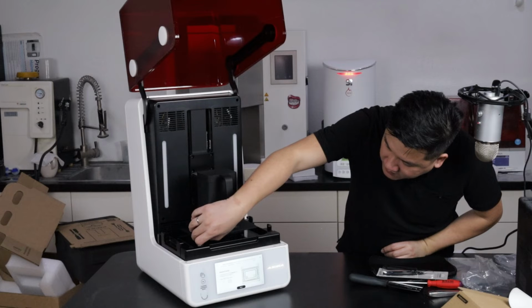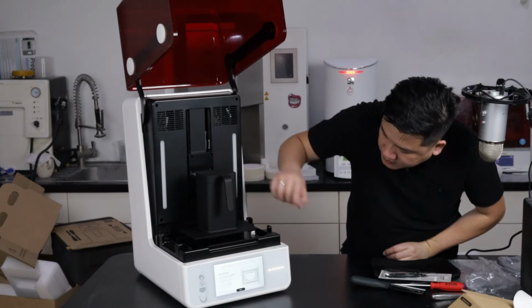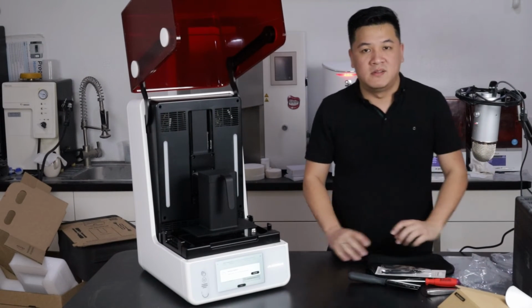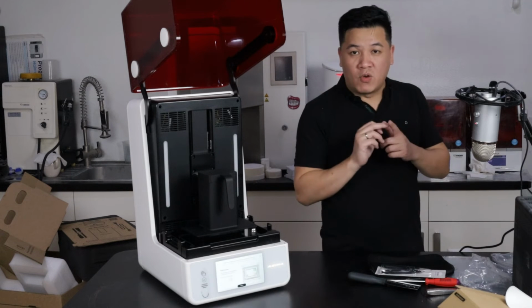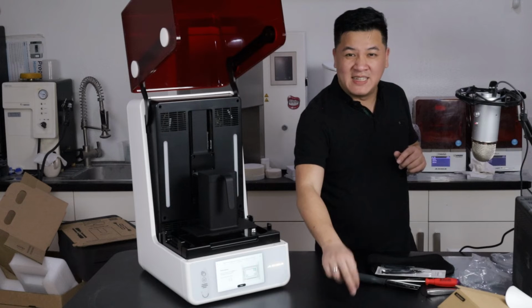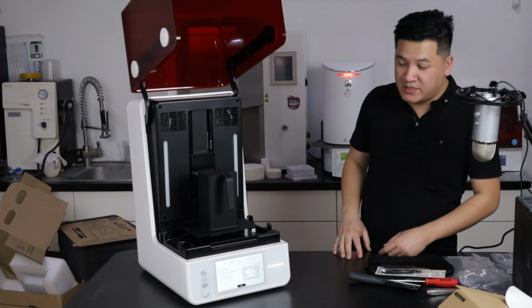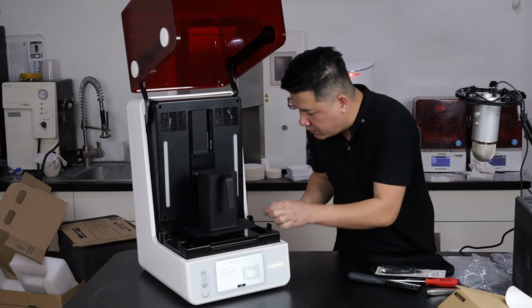Okay, now it's going to ask me to move this to the next corner. Right there, I'm going to hit next. And that touchscreen is wow, miles and miles ahead of the Max. What I found worked really good on the Max was you would have to kind of tap it with your fingernail, so register. This is like if you were using an iPhone or a Samsung. It's just so refined.